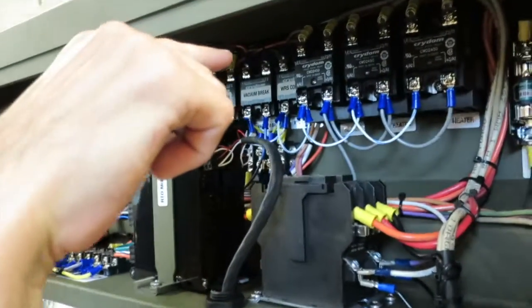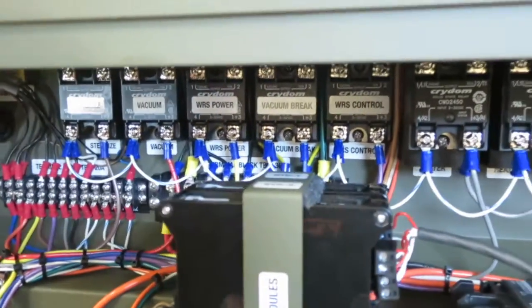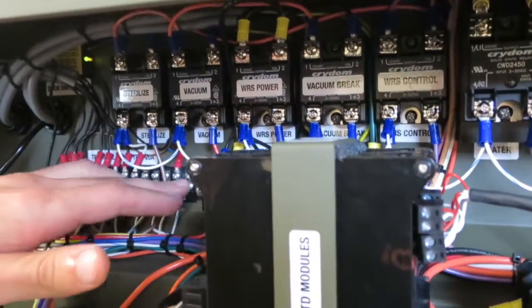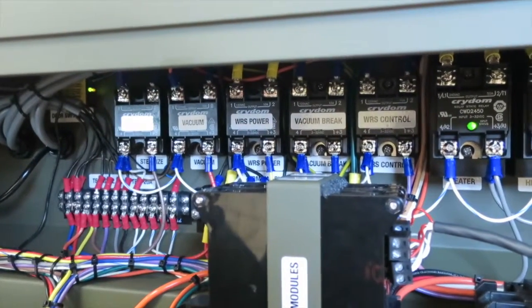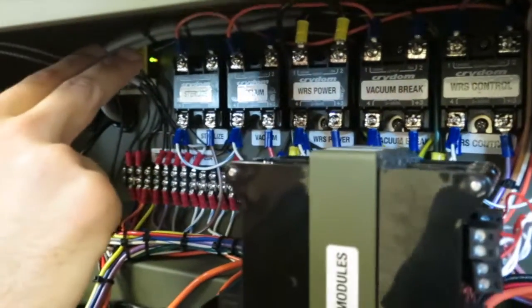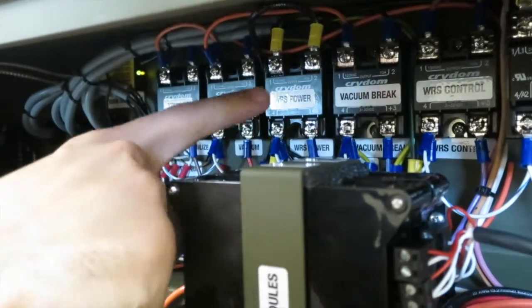So again, that applies to solid state relay 6, excuse me, 6, 7, and 8. Now the rest of the relays over here, still solid state relays, but they fire a lot less than those three, so they're not mounted on heat sinks. You'll notice they still are connected to the PLC through the wires on the bottom. So this brown, red, yellow, blue, and purple wire, those are connected to the output of the PLC. So anytime the PLC says to fire any one of these valves, it'll send 24 volts to the bottom of the relay. It'll complete the circuit across the top and send 120 volts to, say, the STERILIZE valve, which is solid state relay 1, the vacuum valve, which is solid state relay 2, the water recovery system power.